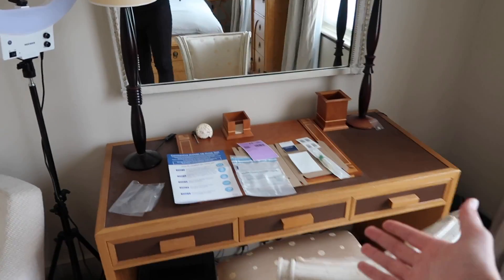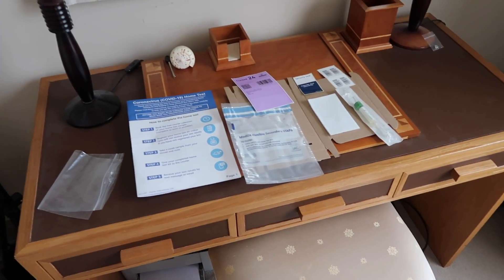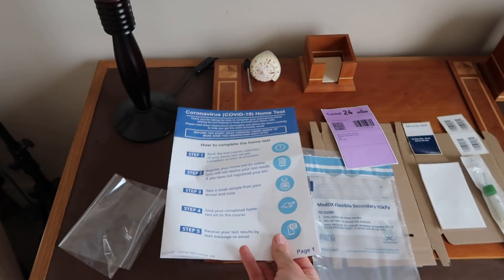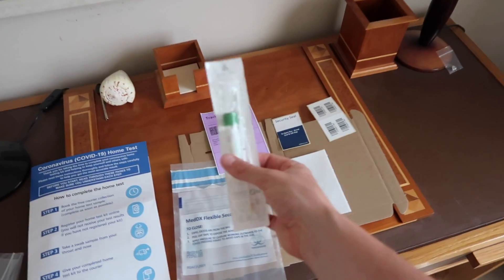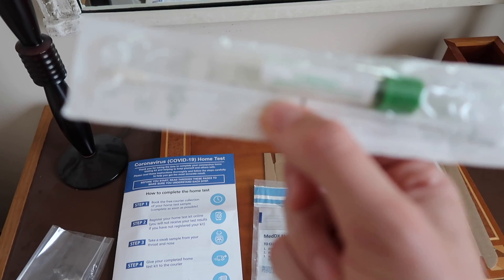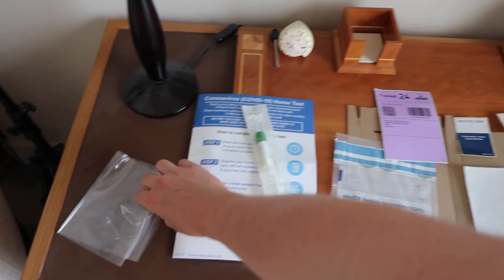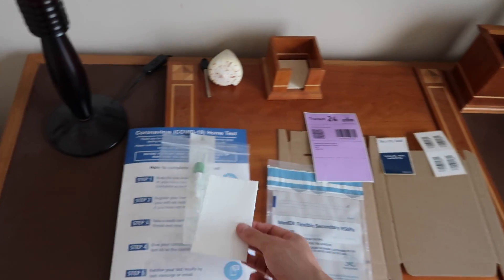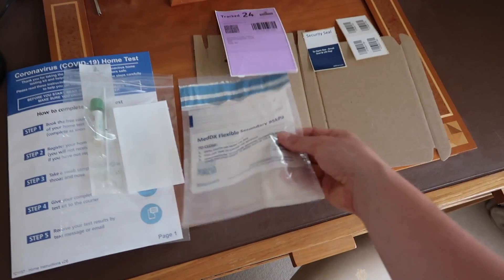Now let me turn the camera around and show you the desk and the actual kit and what comes in it. First, you've got an instruction leaflet which is very useful — it takes you step by step through everything you need to do. You've got the actual swab kit itself, which is sealed and contains a test tube and the swab stick you'll use to take a swab from your throat. You've also got a small clear plastic sleeve in which you place an absorbent pad along with the swab kit when you send it.